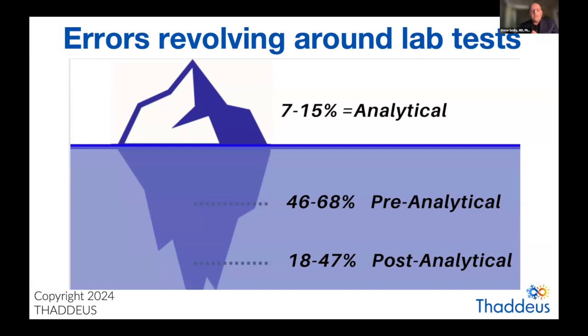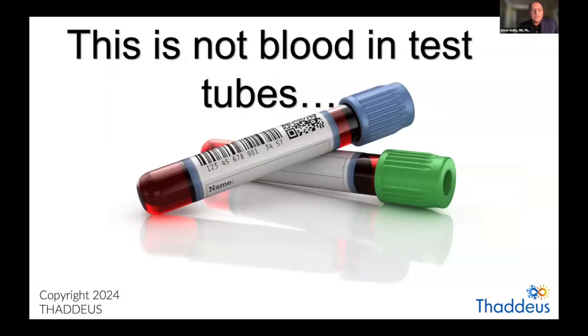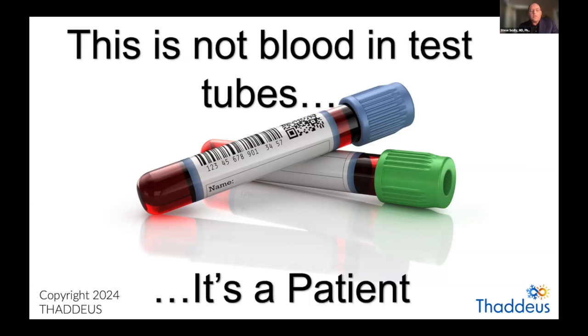And so the pre-analytical phase is the most important phase, in my opinion, of trying to eradicate medical errors because it's where the majority of the errors happen. So we're focused on extreme heat, extreme freezing, and drops and shocks to patient specimens. And again, this is blood from a patient, but if you look at it holistically, this is really a patient that we're treating. It's a representative sample of the current state of the patient.